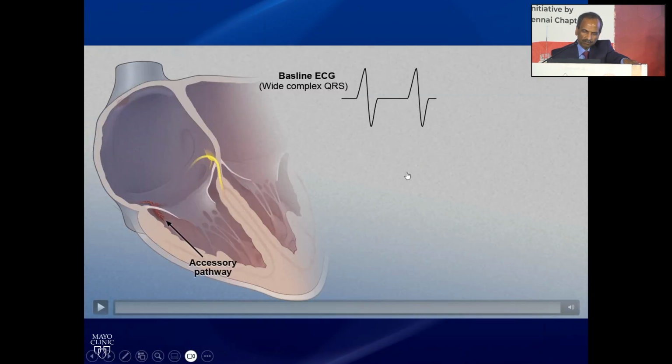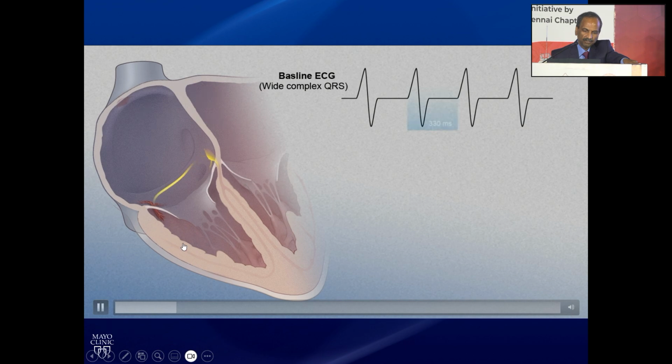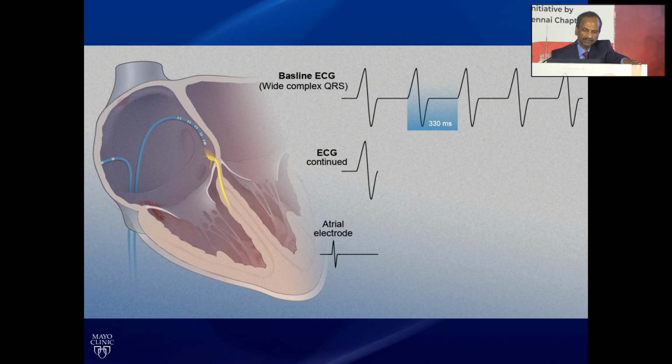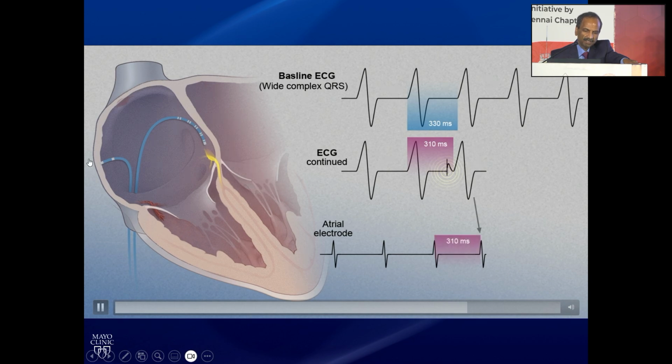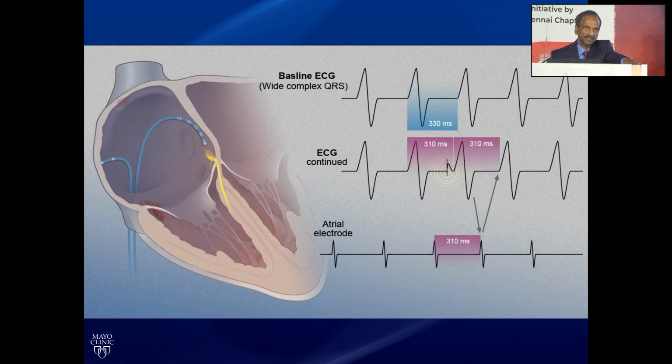Just one last comment about diagnosis of this antidromic tachycardia. It's very commonly mistaken for VT or bundle branch block. Key point is keep a catheter on the septum, pace from the free wall, and see when you pace, are you able to get to the V without even getting to the septal A. If you don't even reach the septal A, you cannot reach the AV node. That means you're going through a pathway. If that produces the same QRS and resets the tachycardia, that is this antidromic pathway.